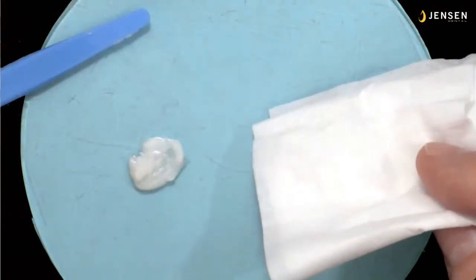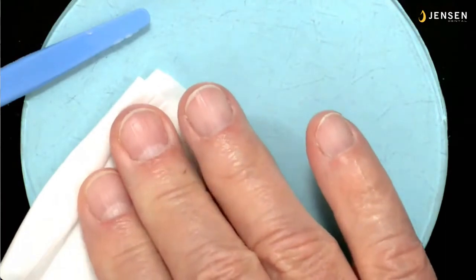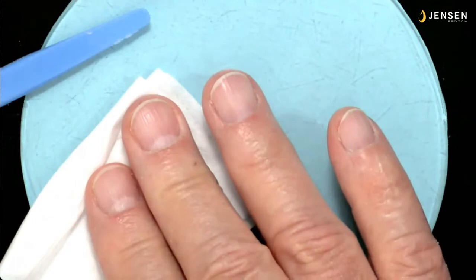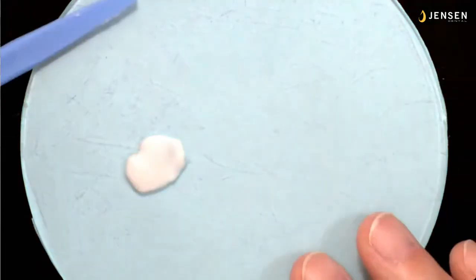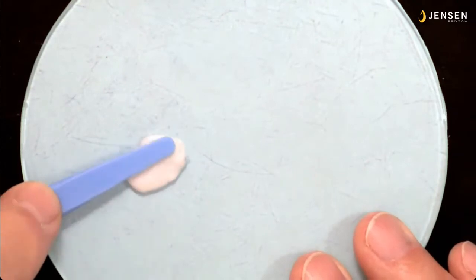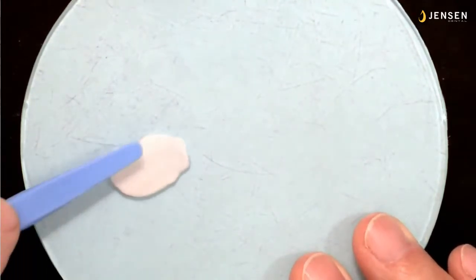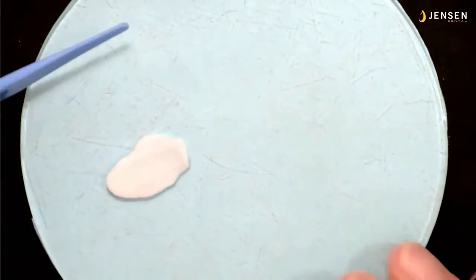So you can take a tissue and you can blot it. And if you blot it with your tissue, it's not going to be quick like porcelain. Because of the glaze liquid, the viscosity of it, it doesn't want to blot out fast. So think about 10, 12, 14 seconds to blot. And then you should be able to slide your spatula on it and it shouldn't stick to it like a tacky, syrupy gum.